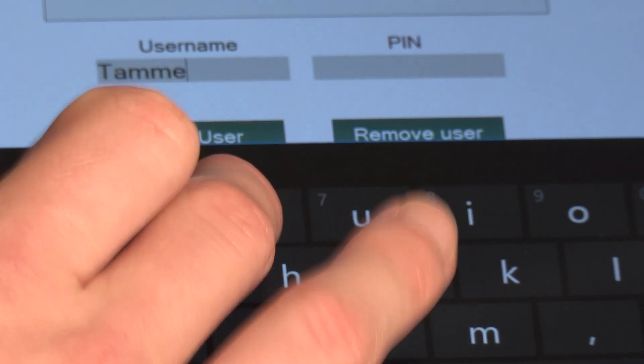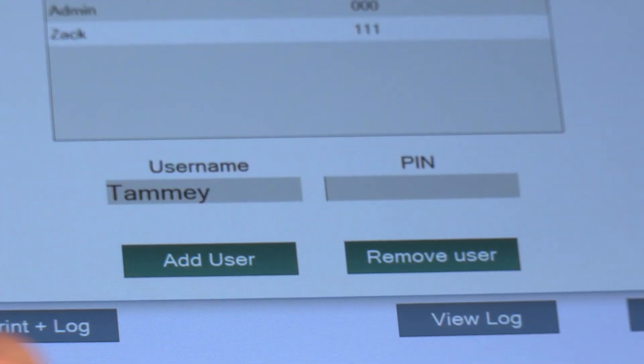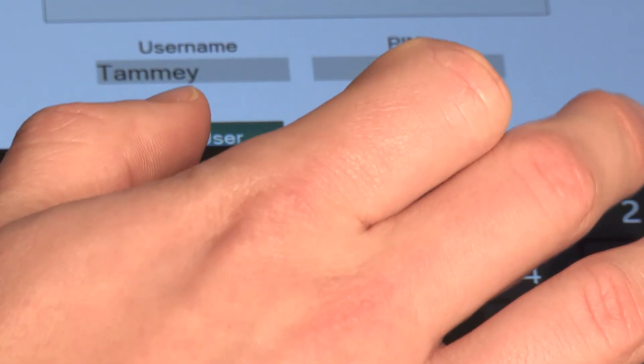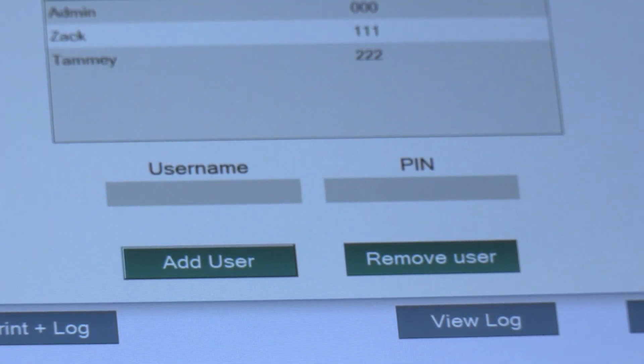So for example we'll add Tammy and we'll assign a PIN, for example of 2-2-2, and then hit Add User.